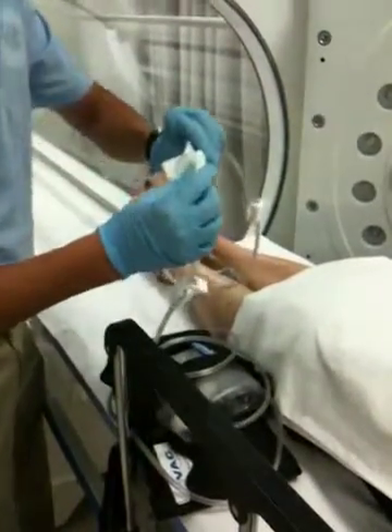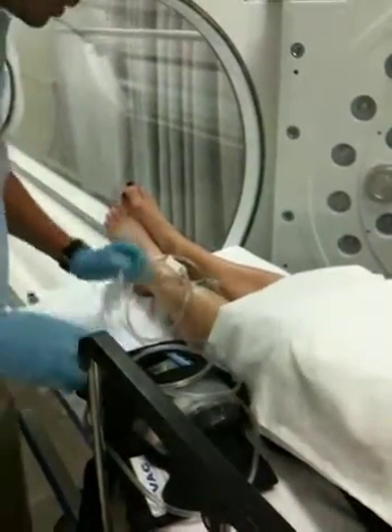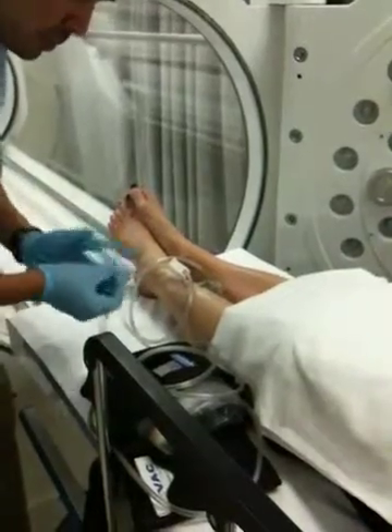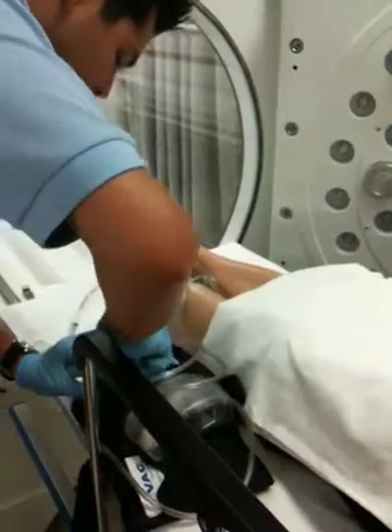Now you can see it's connected, or reconnected. Toss the 4x4 and you can turn the wound vac on.